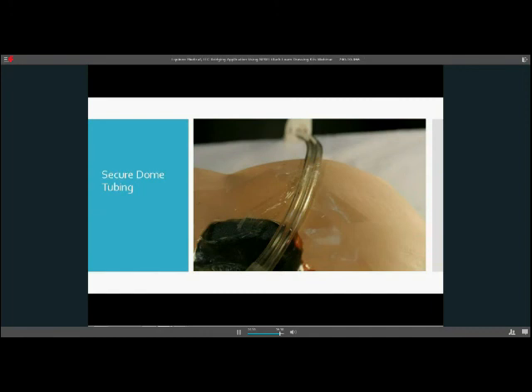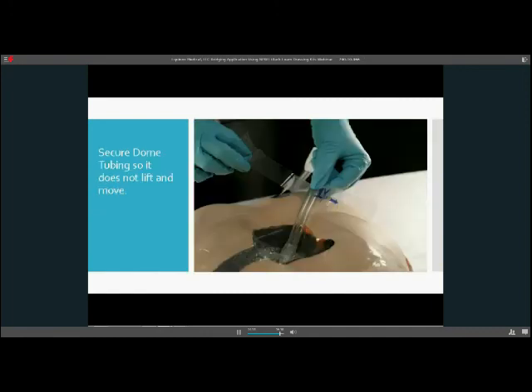If the patient has any skin integrity issues, you could always put maybe a small piece of black foam, a small piece of foam or something like that, or gauze under for it to rest on, because this is now the outer. We're not worried about anything. We could just put a little piece of gauze under here and then tape it down. But we just want to make sure that that doesn't pull up and stop pulling on our tubing here.